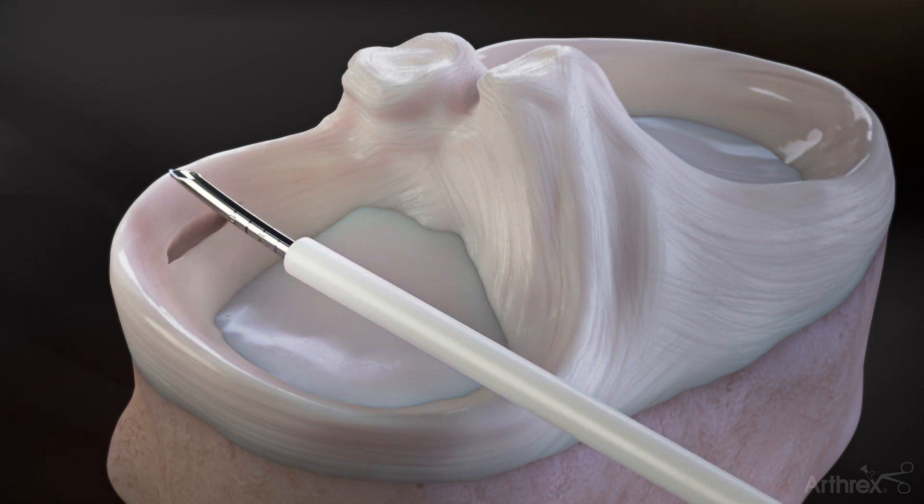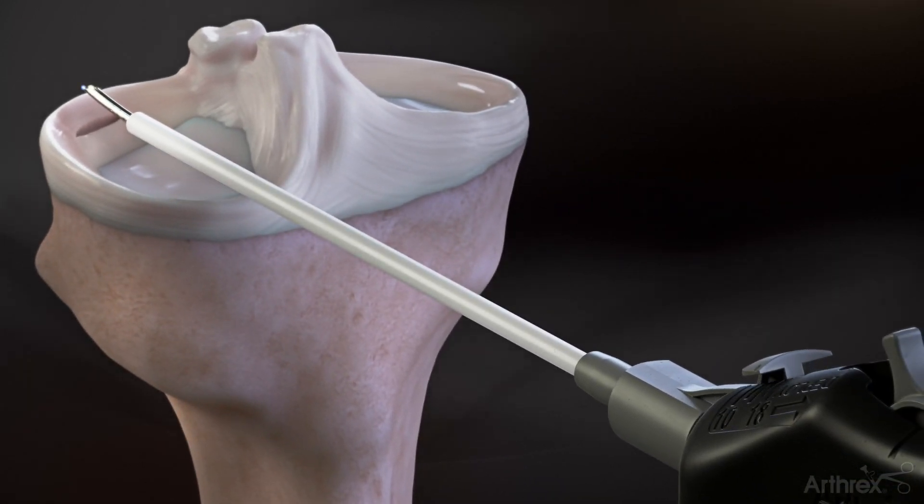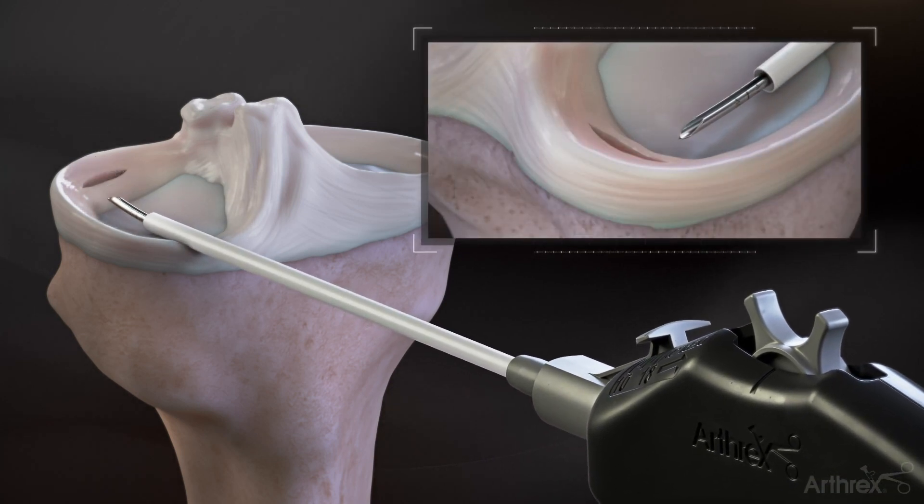Determine the depth of penetration using the laser lines on the tip of the Fiber Stitch, and set the depth stop accordingly by depressing and advancing the tab to the desired setting. Penetrate the tissue to the desired depth.